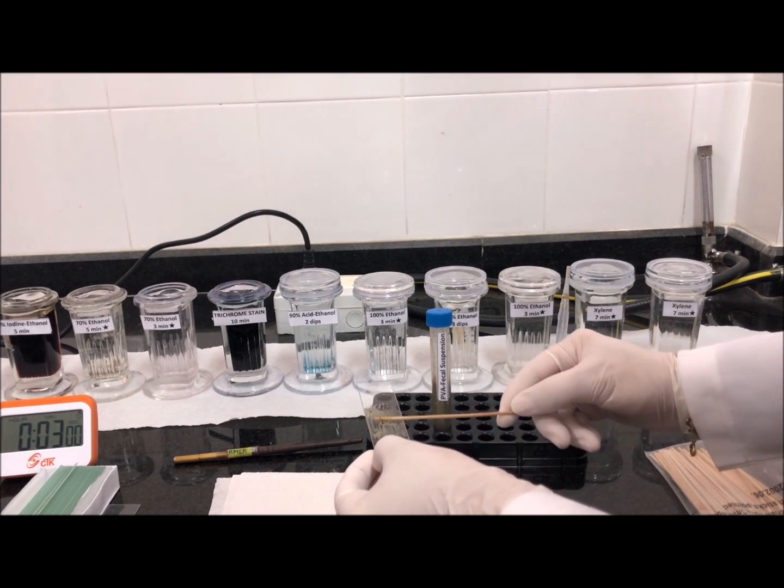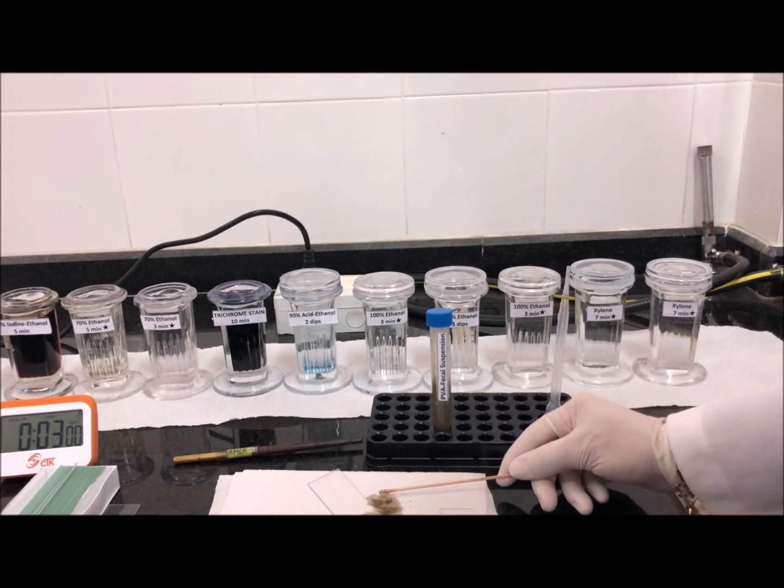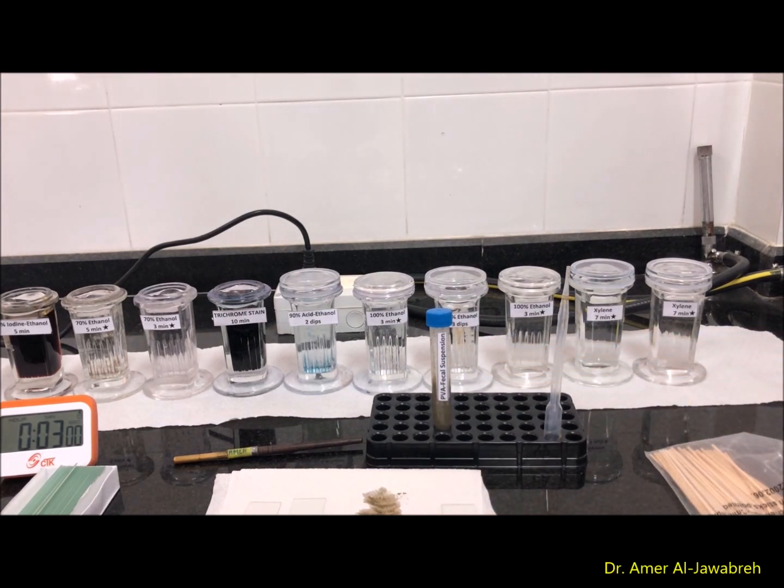It is preferred that you prepare two or three slides so that if one is lost you have a reserve. Allow them to air dry either at 37°C in an incubator for one hour, or overnight. After drying, the smears are ready for the next steps.